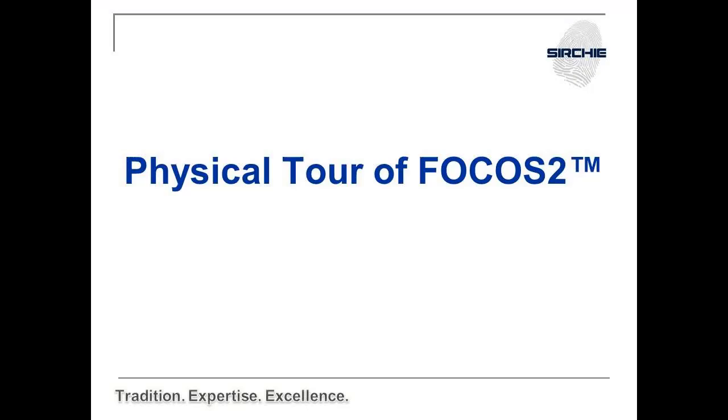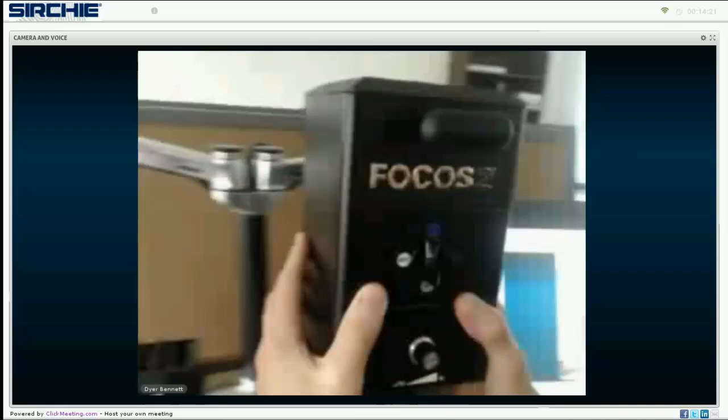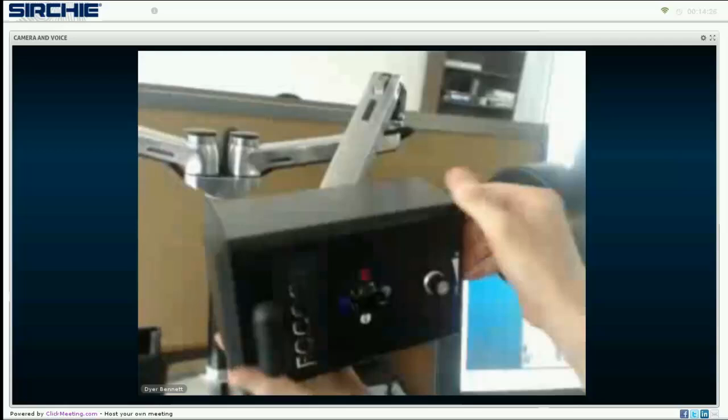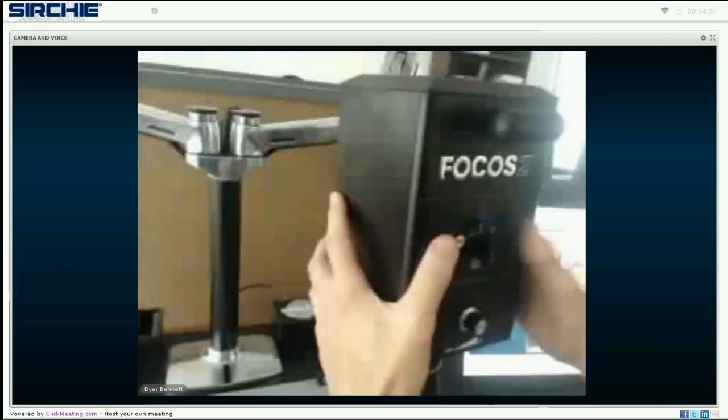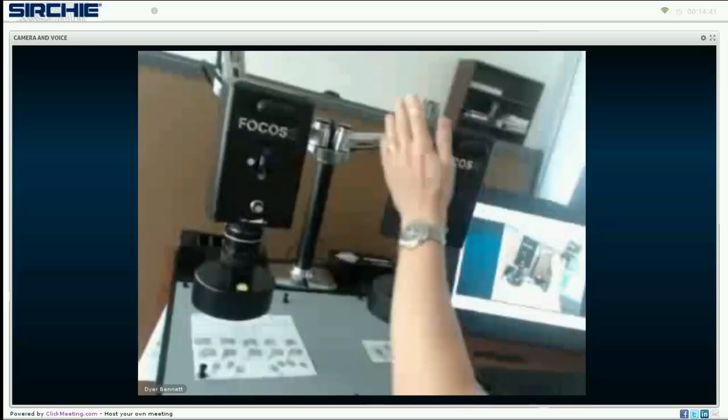Next up is a physical tour of Focus 2. The cameras sit on two articulating arms and can rotate, and the camera itself can also rotate 90 degrees in each direction. These are two cameras sitting on two arms, and it also sits on a magnetic base, as you can see from the magnets. It comes with a gray cover mat.